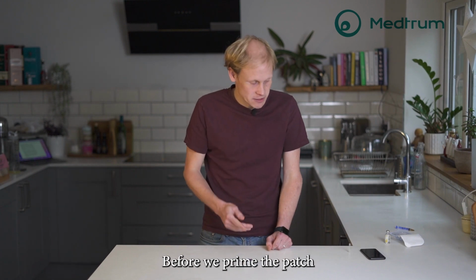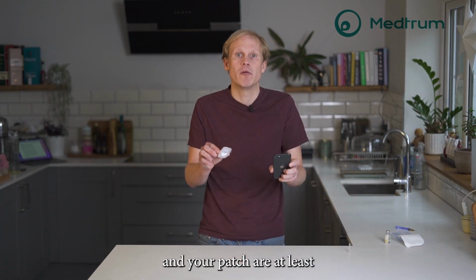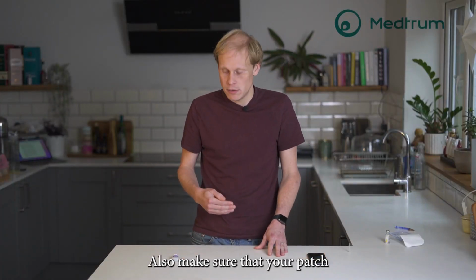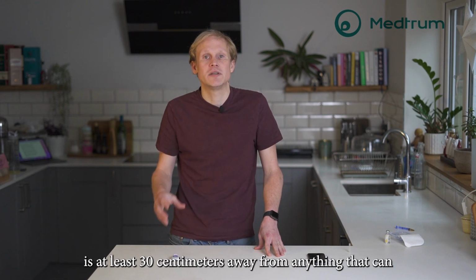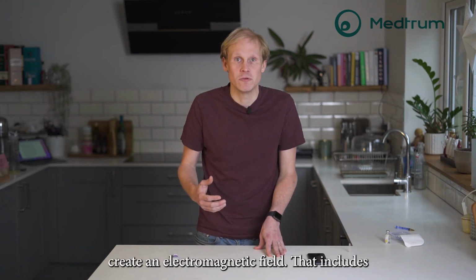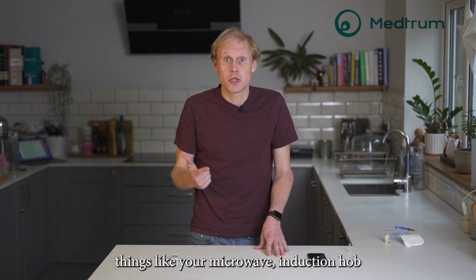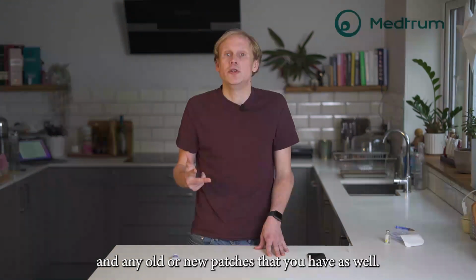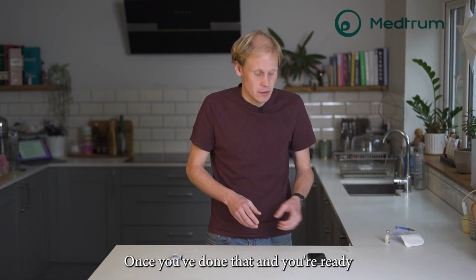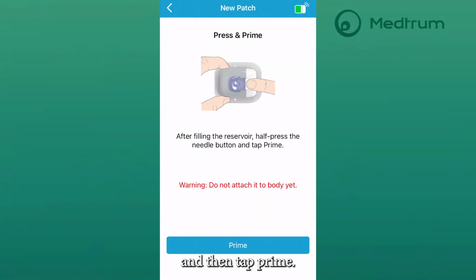Before we prime the patch, make sure that your mobile phone and your patch are at least 30 centimeters away from each other. Also, make sure that your patch is at least 30 centimeters away from anything that can create an electromagnetic field. That includes things like your microwave, induction hob, and any old or new patches that you have as well. Once you've done that and you're ready, you can access your app on your mobile phone and then tap Prime.